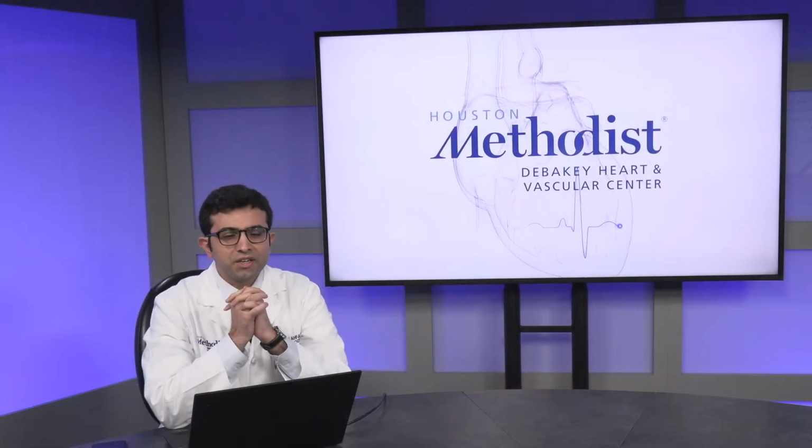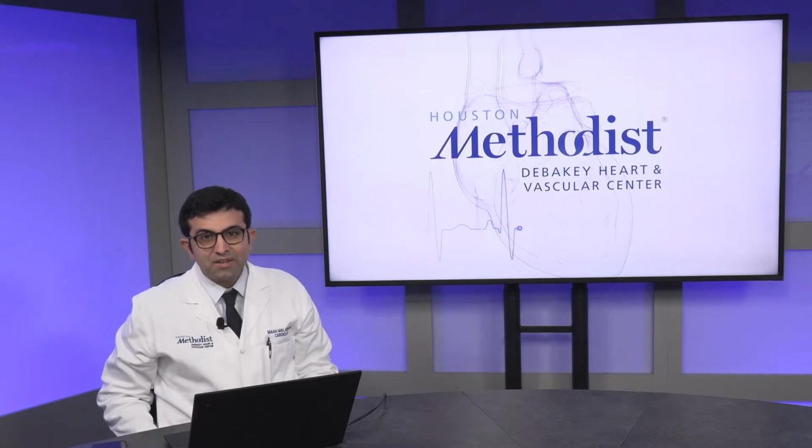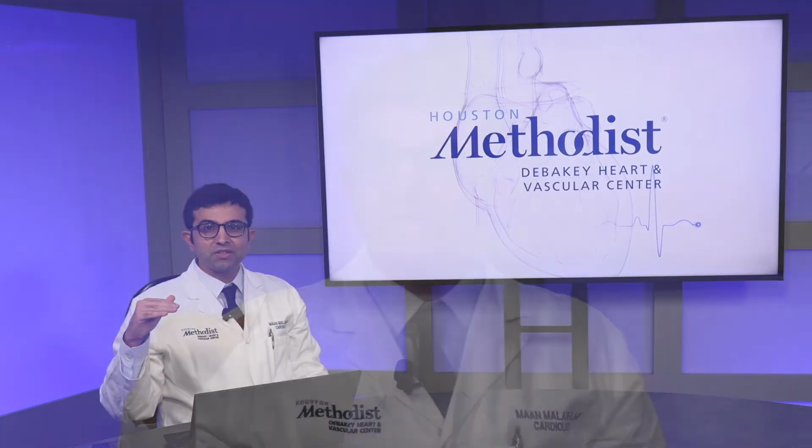All right, thank you, Dr. Chang. That was very, very helpful. While I certainly agree that the CT benefit is not having to deal with that basal slice right under the mitral valve, I'm curious if we have any questions from our local audience or from the group here about your proposal, a single heartbeat, full 3D volume CT acquisition. Many programs are going to be getting CT scanners, so I think it'll be very helpful. And like you said, a very nice research method.